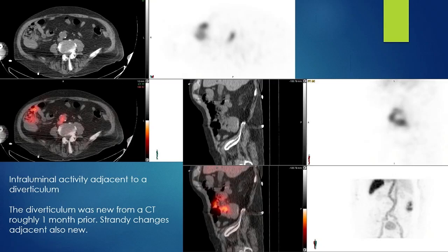Regarding colonic versus small bowel bleeds: a colonic bleed typically goes around the expected location of the colon — it can move anterograde and retrograde — and while there can be redundant loops of transverse or sigmoid colon, it's usually pretty wide. Small bowel, on the other hand, is all swirly, and activity frequently is faint and moves very quickly, making it difficult to demonstrate.